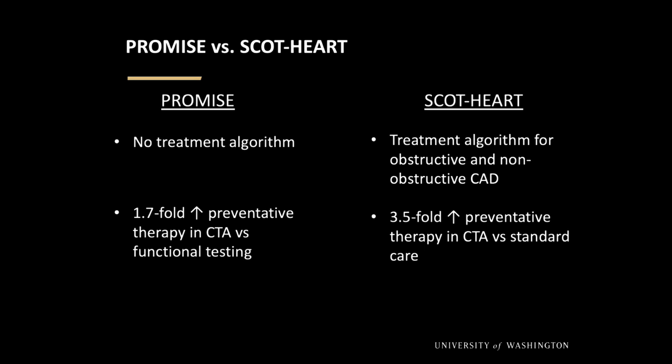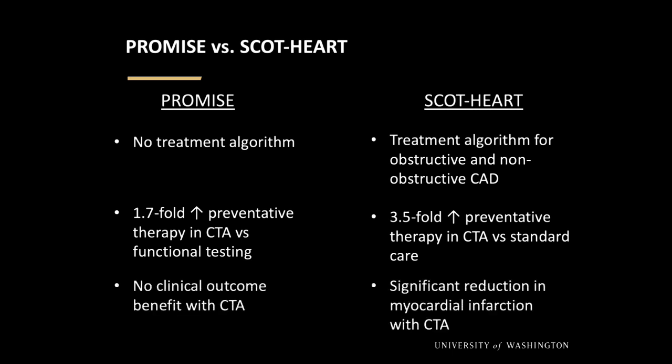In PROMISE, about a 1.7-fold increase in preventative therapies in favor of CTA. But SCOT-HEART is actually a 3-fold increase, and maybe even higher if you just looked at aspirin in the CTA arm versus standard of care. PROMISE had no difference in outcomes, and then SCOT-HEART had a significant reduction in MI with CTA. But I will say that there's more than just this that accounts for the difference in outcomes.